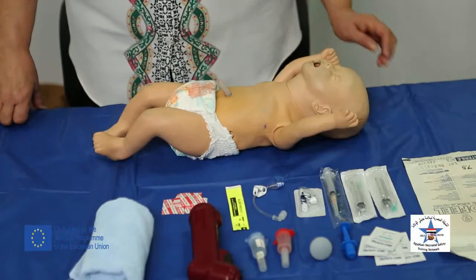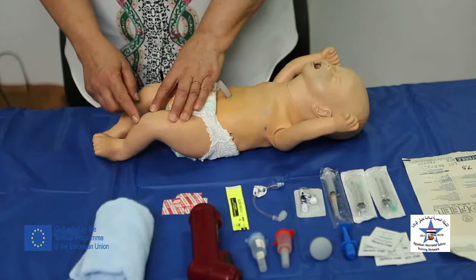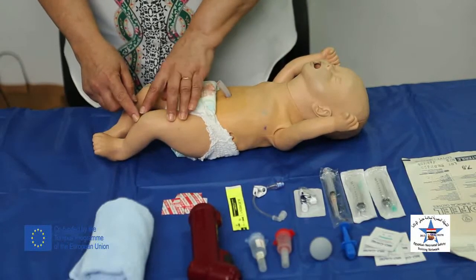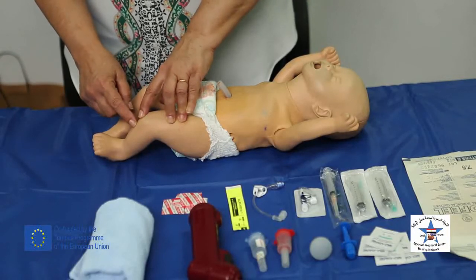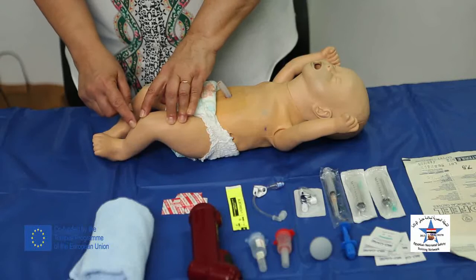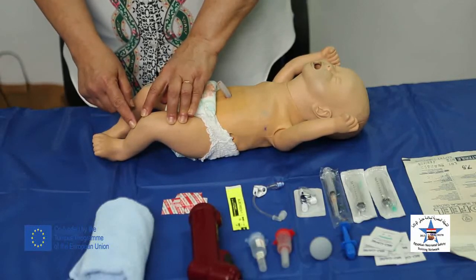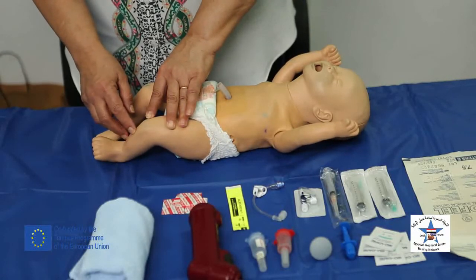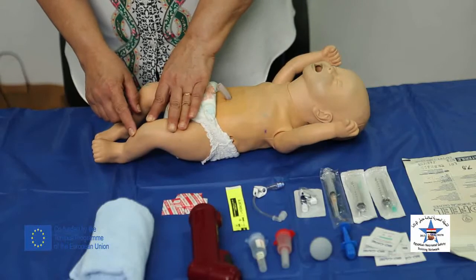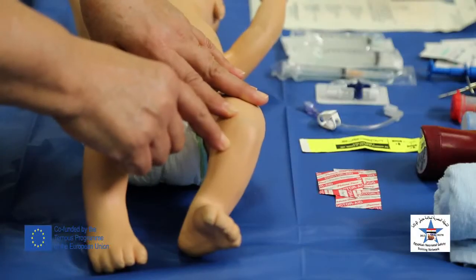To locate the site of insertion in the proximal tibia, we will first locate the patella, and then the lower pole of the patella. We will look going distally, or moving distally. We will palpate the first bony prominence, which is the tibial tuberosity. Around 1 to 2 centimeters below the tibial tuberosity and to the medial side is the site of insertion.